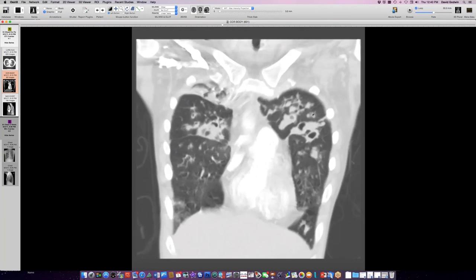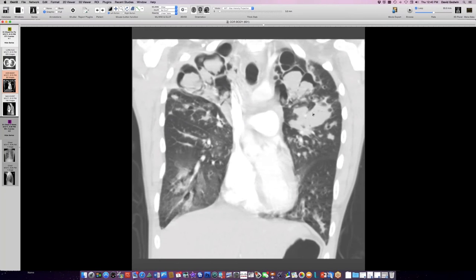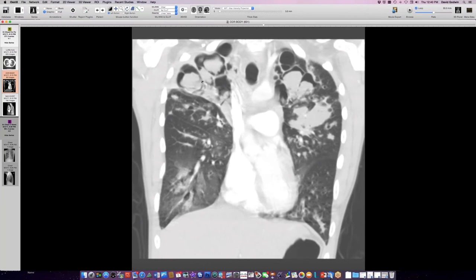And she was readmitted this last week. She's in a lot more respiratory distress. She now has a tracheostomy and everything like this. This is her current imaging, and at this point her chest radiograph is worse than the chest radiograph I just showed you, but I just want to show you these bilateral mycetomas occupying her apical cavities.